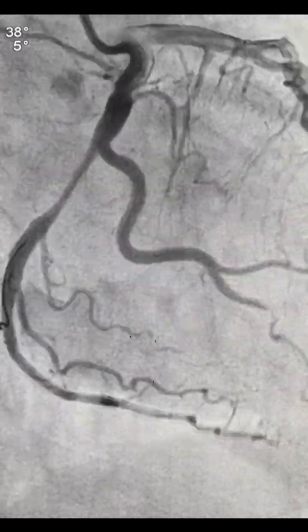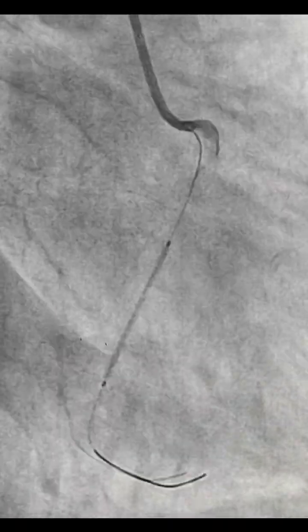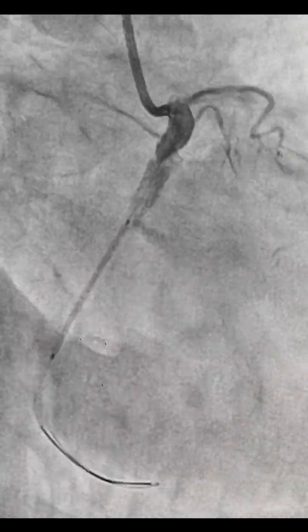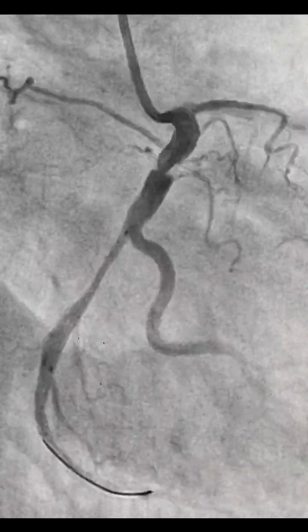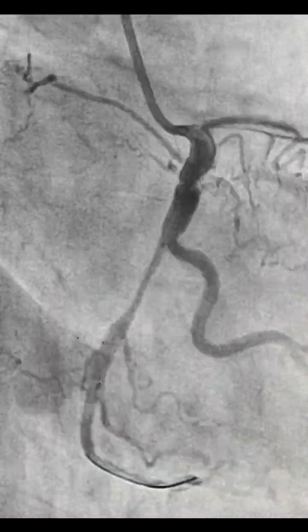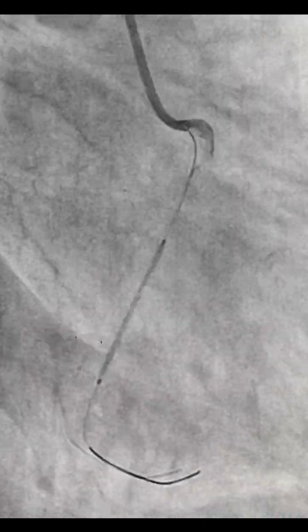In such a large ectatic artery, stent size has always been a problem. This was a 4.0 stent which we deployed in the distal LCX. This was the positioning of the stent.